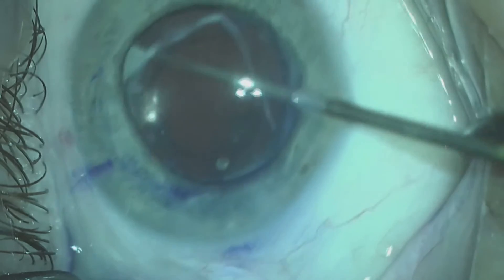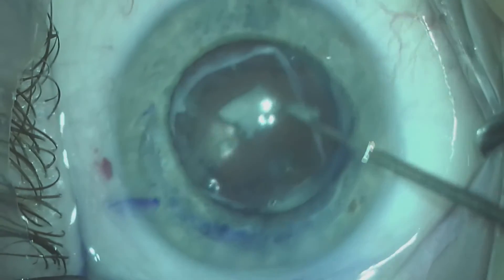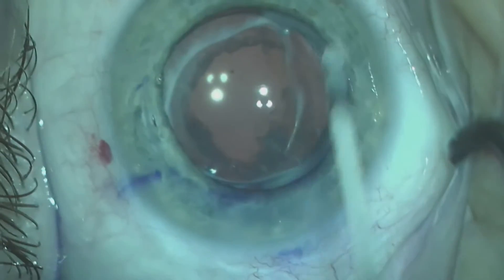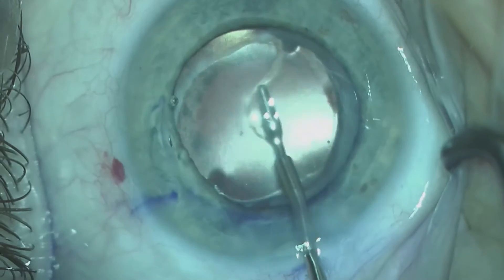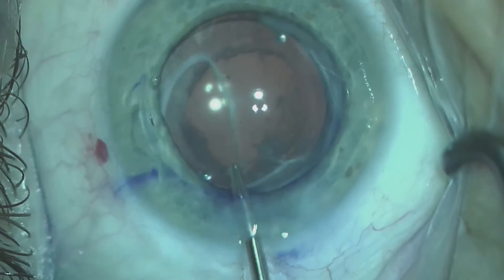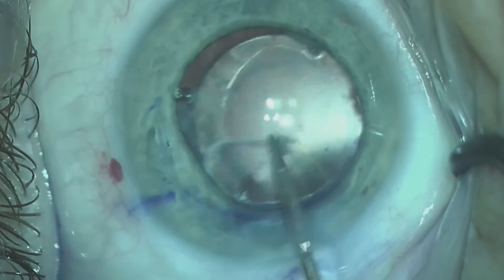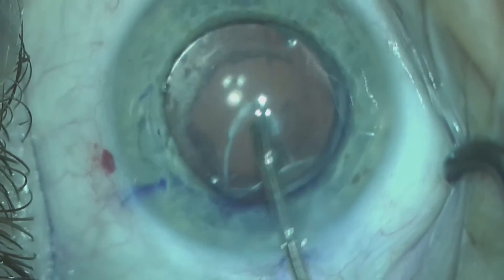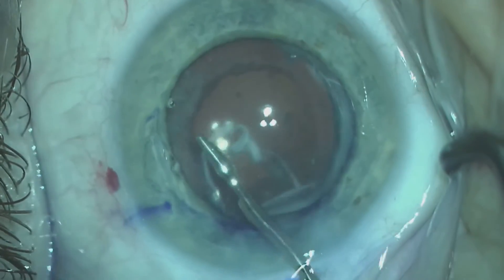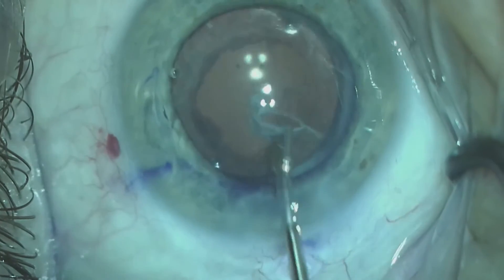I go back in with a Sinski hook and try to free up the remaining cortex at 9 o'clock. I get this out of the eye and reattempt to free the lens. It does not free up, so at this point I use an MST micro forceps to free up and remove the anterior lens epithelial cells. Some of these cells were very adherent to both the lens and the capsule, but we were able to free them up and remove them nicely, which aided us in getting this lens out of the bag.